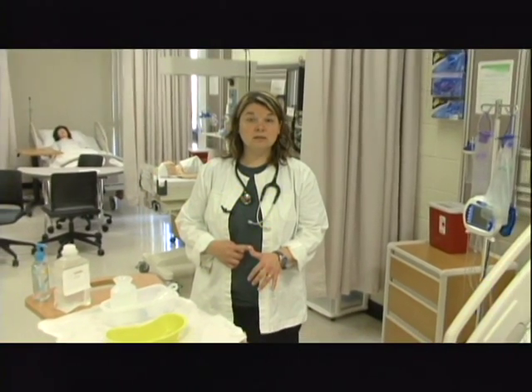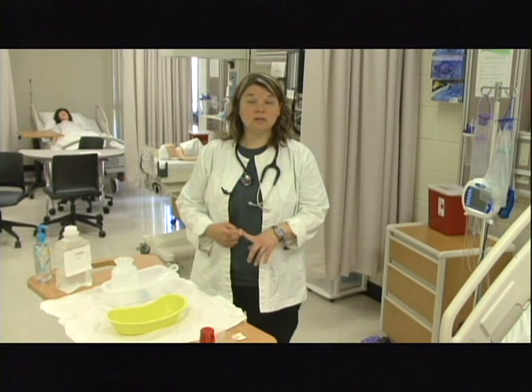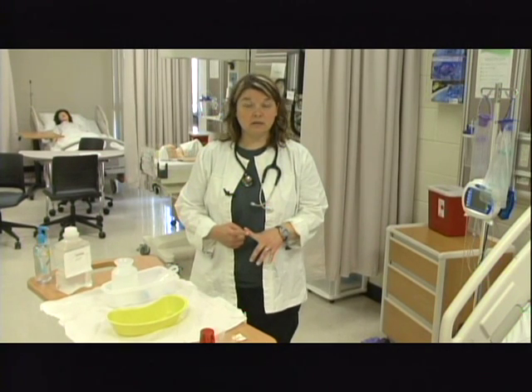So now I'm going to discuss tube medications with you. The first thing I would need to do outside the patient's room is make sure that I had verified the orders for medications and verified all of the medicines that I was giving. As I'm going through and giving medications, I would always do my 3 checks. And I always need to practice the 6 rights of medication administration, and you will have seen these in a prior video.